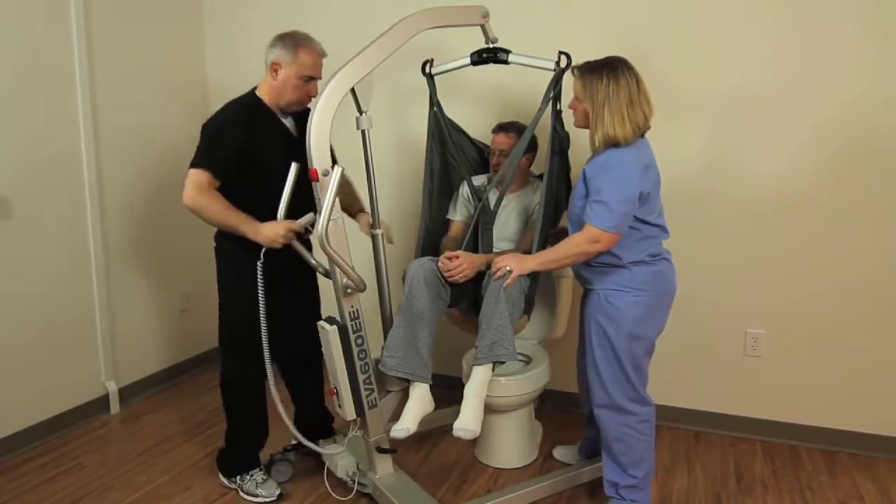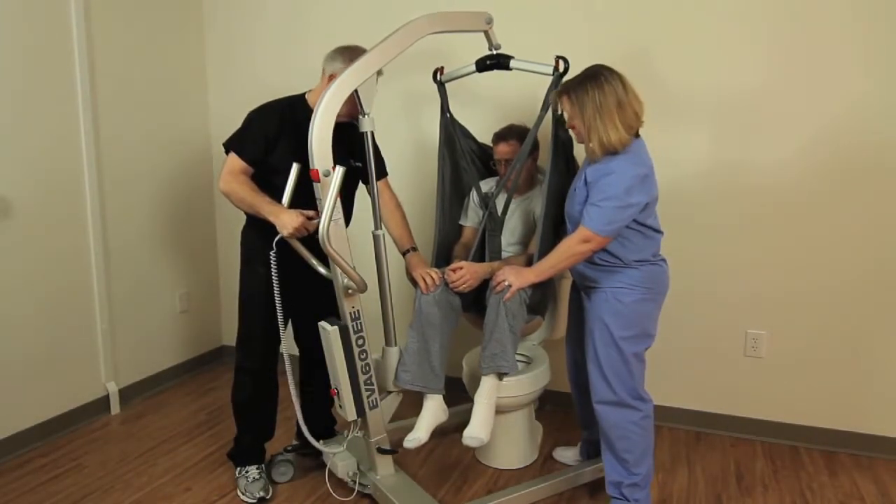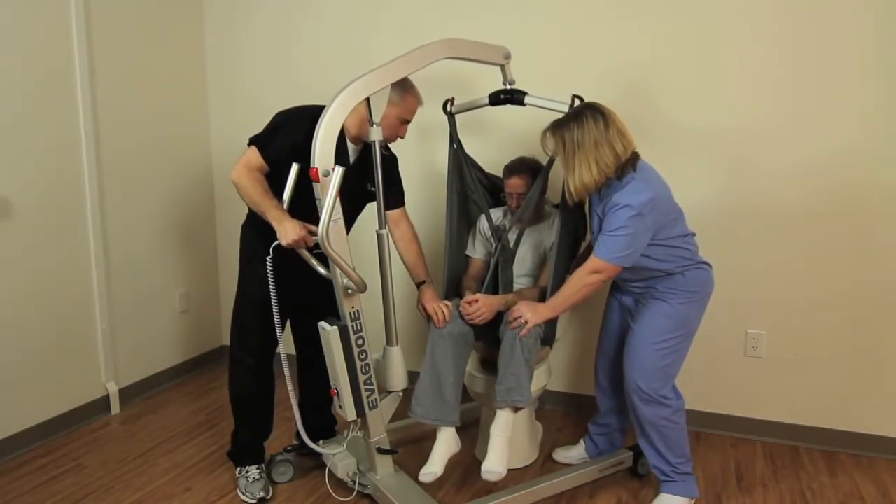Provisions must be made for partially or completely removing clothing, undergarments, or incontinence briefs. The removal should be accomplished or planned prior to applying the high back sling.